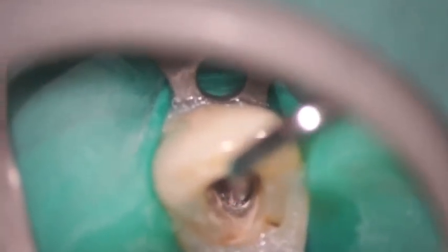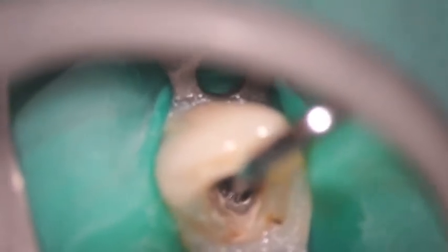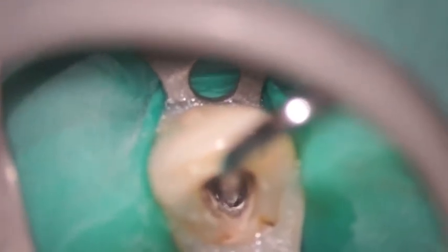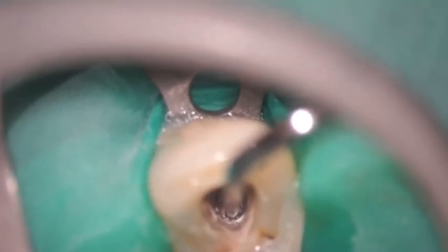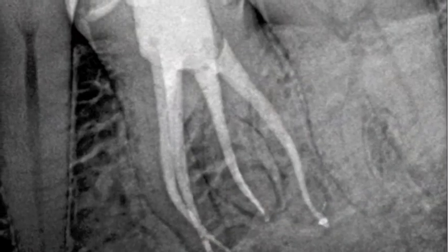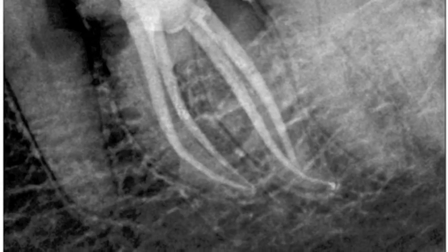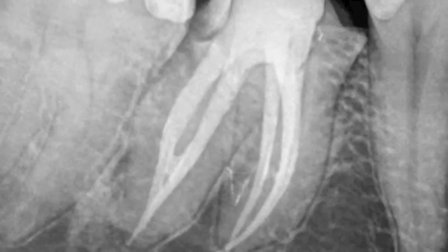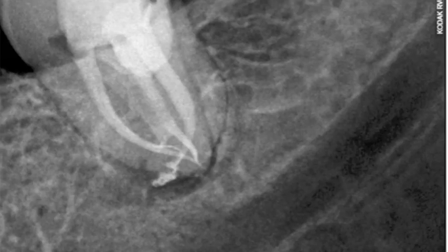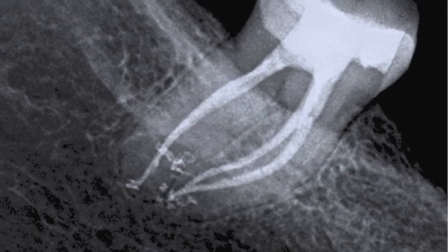Sometimes you think a system will be relatively simple because it's a single canal. But if we've done a great job of disinfection and been able to digest all of the anatomy out of the root canal system, it's amazing what we find when we take a final radiograph — and that's where the thrill of the fill comes in. We're able to see some anatomy there that we just never thought possible.